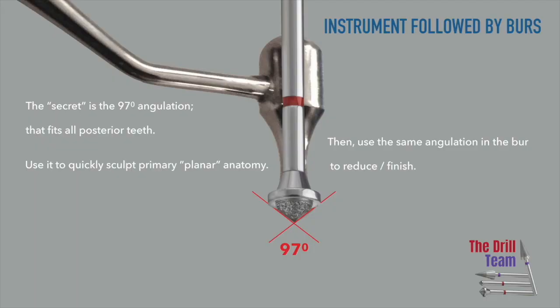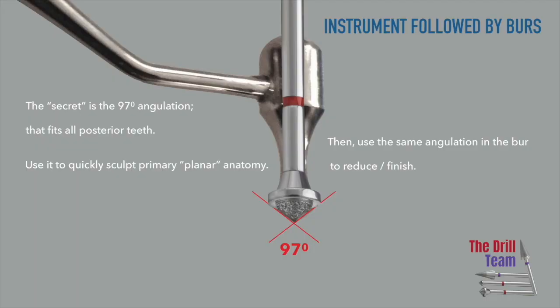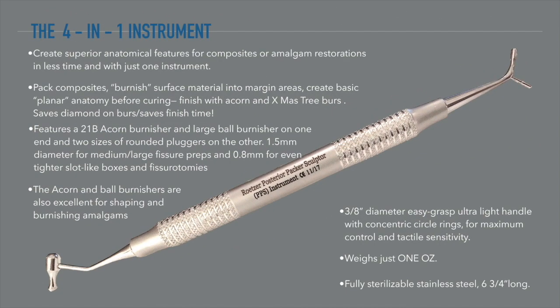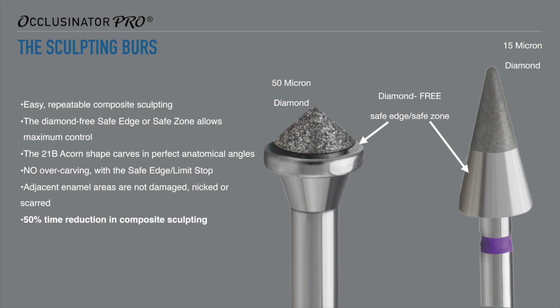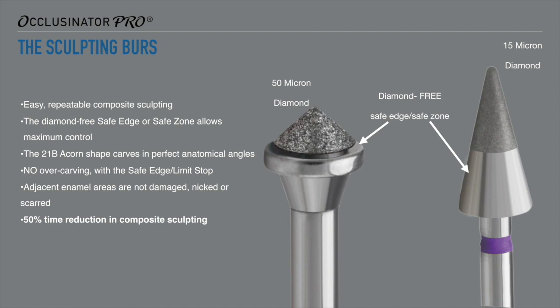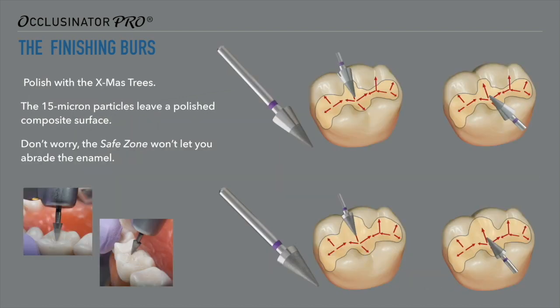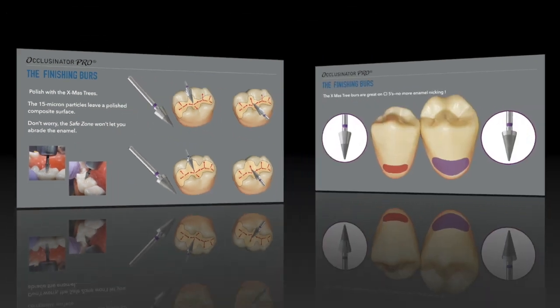It really is that easy. The hand instrument matches the angle and size of the shaping and finishing burrs. You simply pack and overfill by about 10%, burnish the material into the margins and sculpt with the acorn end, create your basic anatomy. Use the 50 micron burrs with a follow-the-dot technique and polish with the 15 micron Christmas tree, resting the safe edge and zone on the enamel surface. As an added benefit, the Christmas tree burrs can be used to finish off class 5 restorations as well.